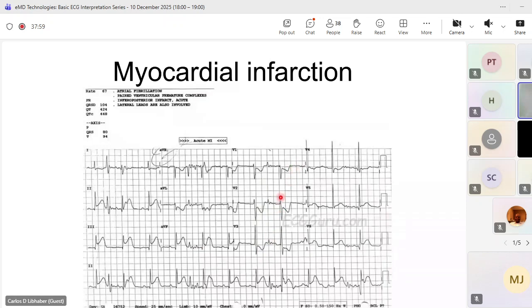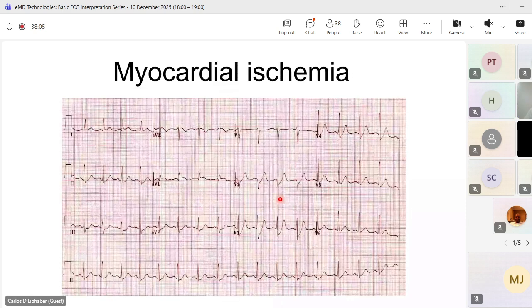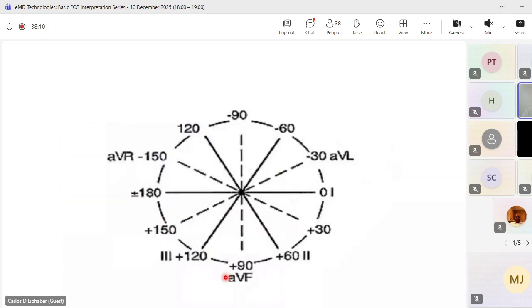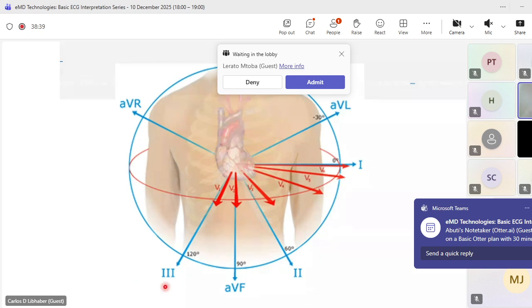So if I go back, I said, I see it in lead 2, lead 3, AVF. So that involves, remember, F, feet. It's happening in the inferior segments of the heart, in the inferior wall. And V6, lateral. So inferior and lateral.